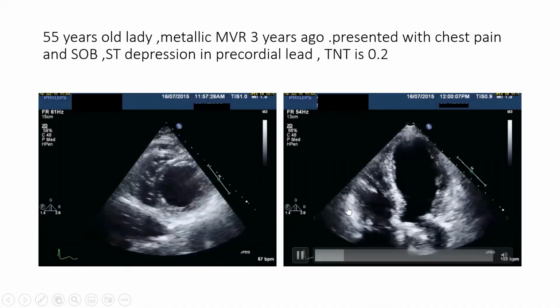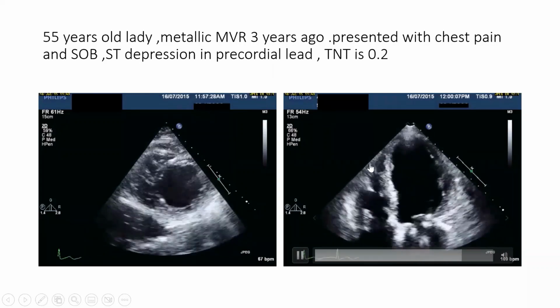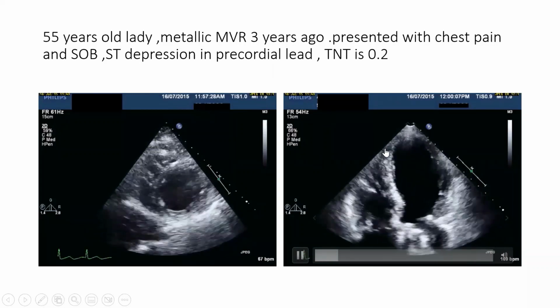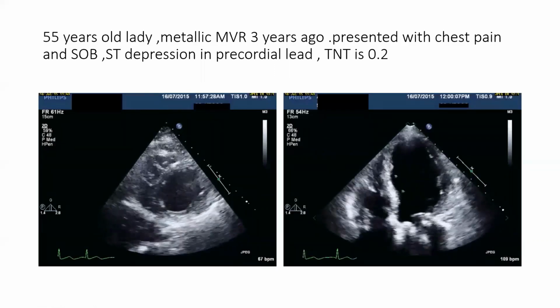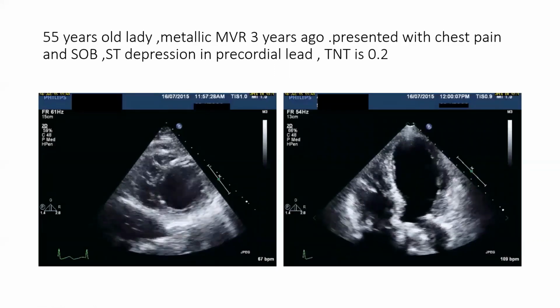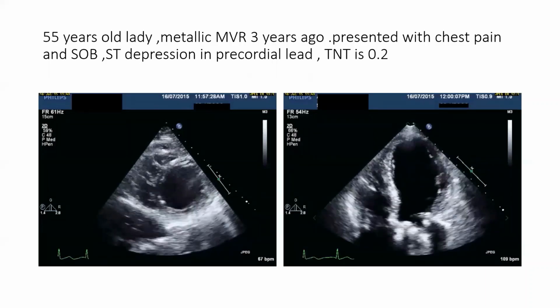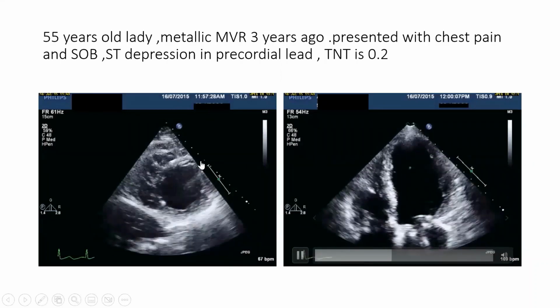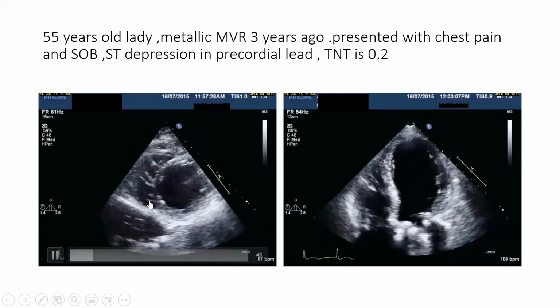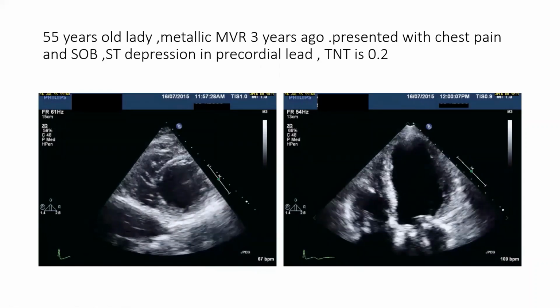You see the RV here? The RV at the base is contracting. When you go down toward the apex, it's not. It is hypokinetic. And this is a very, very suggestive feature of Takotsubo, when you have RV apical hypokinesis. In myocardial infarction, you don't have that.